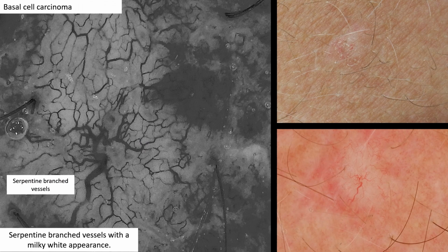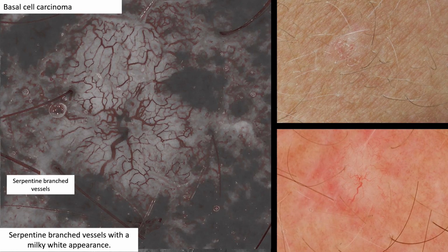Another example, subtle clinically, you have this milky white area with this serpentine vessel dermoscopically in the contact polarized mode. In the near ultraviolet light, you have this beautiful example of these serpentine branched vessels. And with the vascular enhancer, you see it even more prominently.